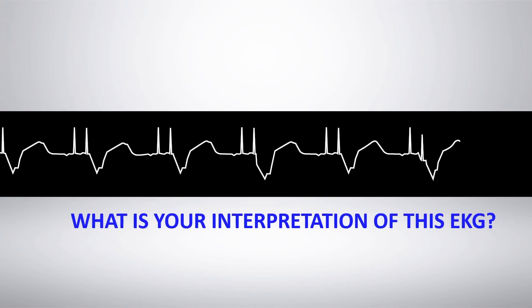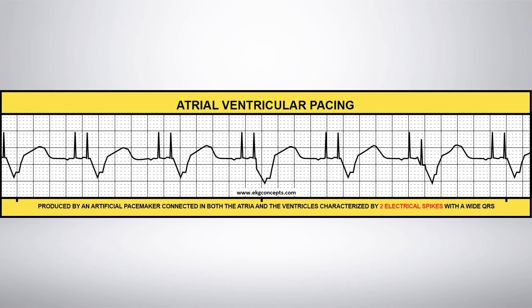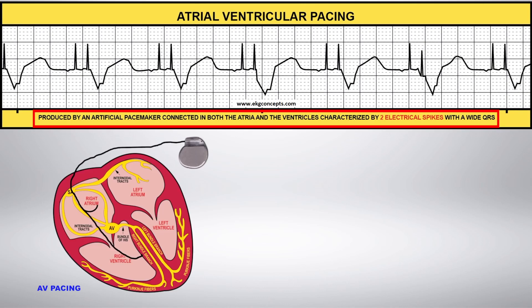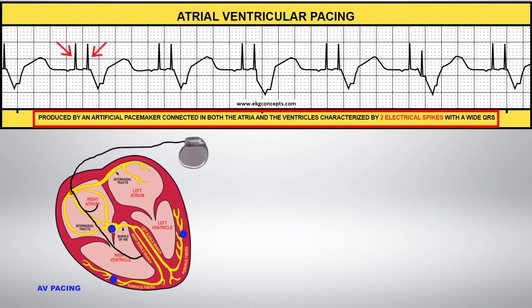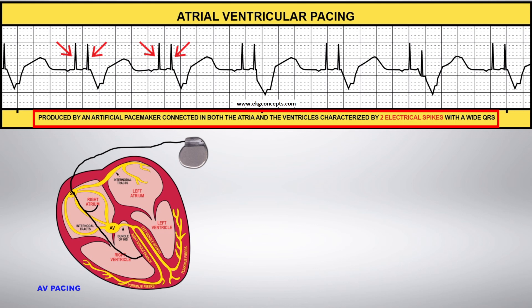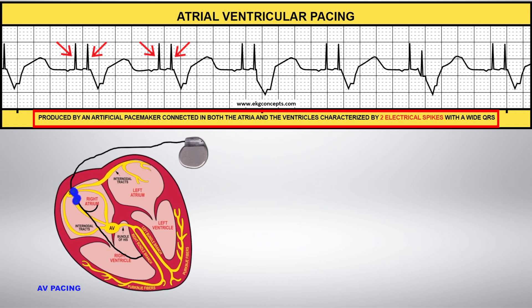What is your interpretation of this EKG rhythm strip? Atrial ventricular pacing, or AV pacing. In AV pacing, both the atria and the ventricles are being paced with a pacemaker lead in the atrium and the ventricle.